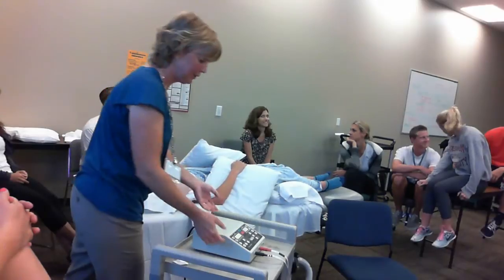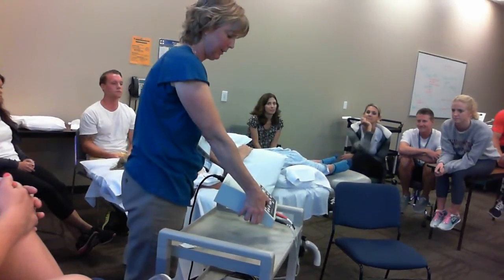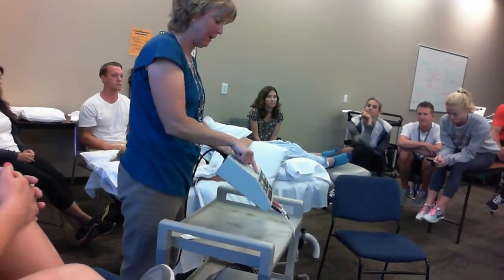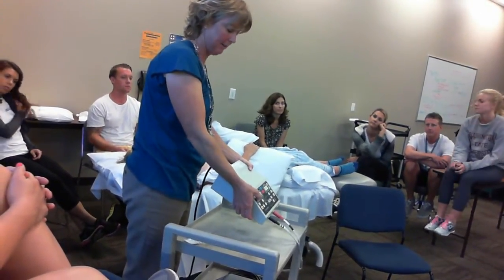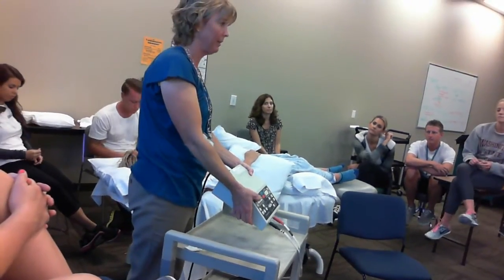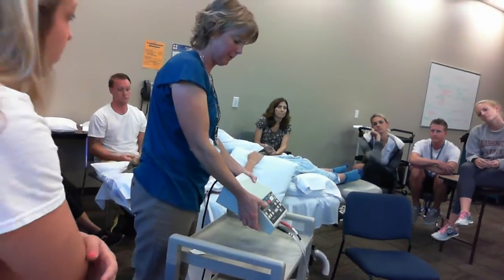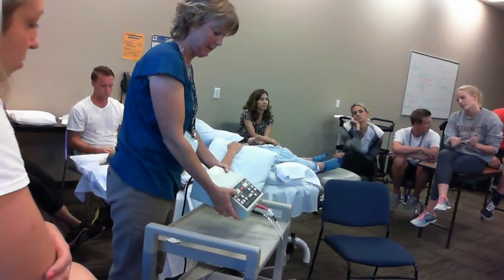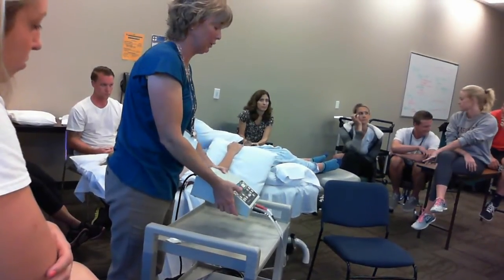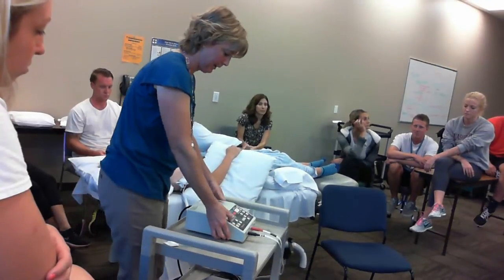Yes. And I could certainly change that rate if I wanted to. I can go back to that toggle and see what the rate is, and it says my rate is 80 to 150. If I wanted to get down to that 75, I could certainly change my rate. If I only want to be, let's say I just read a study and it said 100 to 150 was the best, I can put it at 100 to 150, okay? So you can play around with that, but you don't have to. That's just future knowledge, okay? Put that back down to about where it was.